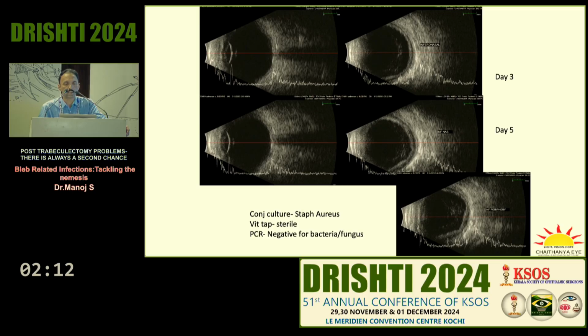But on day 3, the ultrasound started showing some changes. You see vitreous exudates appearing, and also the retinochoroid is kind of thickening. And at this point, we decided the patient has moved from stage 1 to stage 2, and we gave an intravitreal injection. On day 5, again, you see there is still an increase in exudates and increased thickening, and the patient received yet another intravitreal injection.